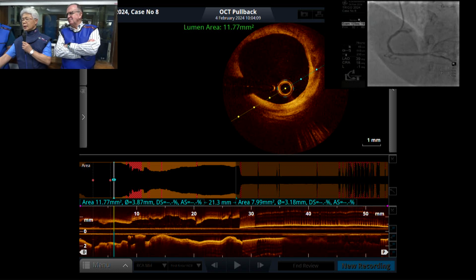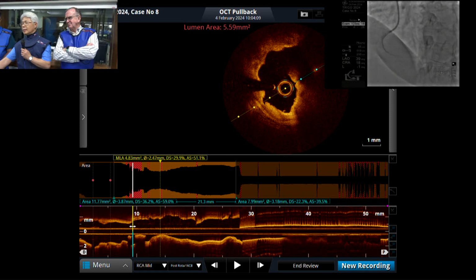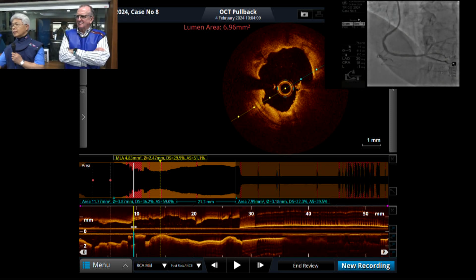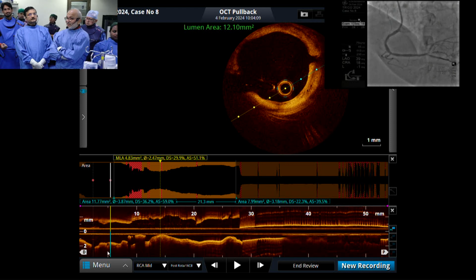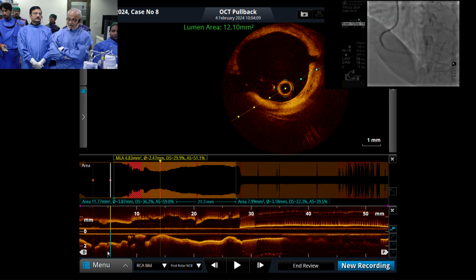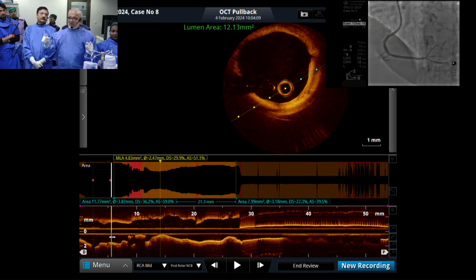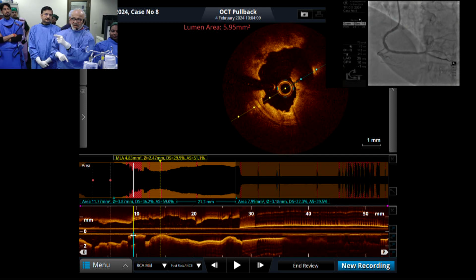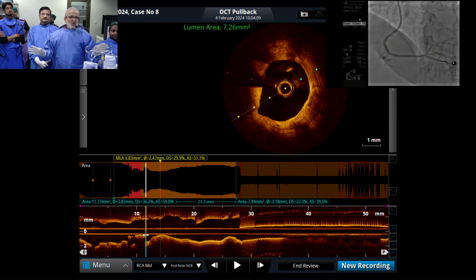So, I would like to restrict the distal strut to protrude into that ectatic segment, maybe 1 or 2 millimeter, that is fine. But I will not go ahead with a 3.5 stent, for sure. I mean, our American friends may have a disagreement with this, but yeah, I will do that. Another thing, I can visualize the post-stent OCT run in this case, where you will not see completely circular areas and you will find significant malapposition in a very short segment of that nodule and oval region. But that is all right.